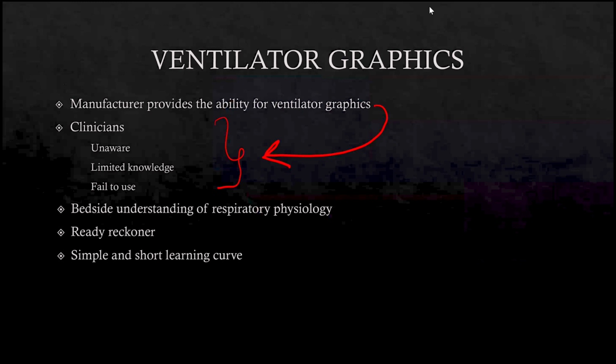It gives a good idea of the changing status of respiratory physiology, especially in patients with respiratory problems like ARDS and COPD, because these are dynamic conditions, and the trend of change can be picked up early if we are familiar with ventilator graphics.